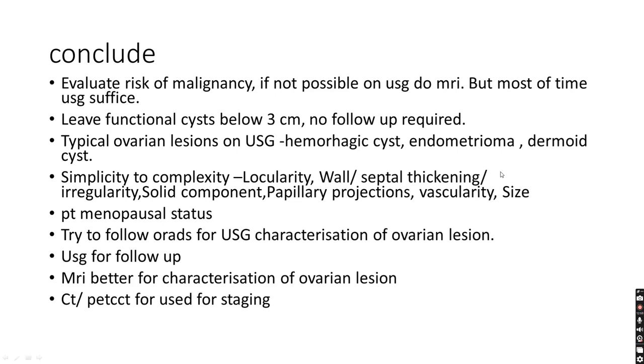And we should take into account the size of the cyst, then the morphological features like septations, locularity, solid component, papillary projections, vascularity ranging from none to high vascularity.